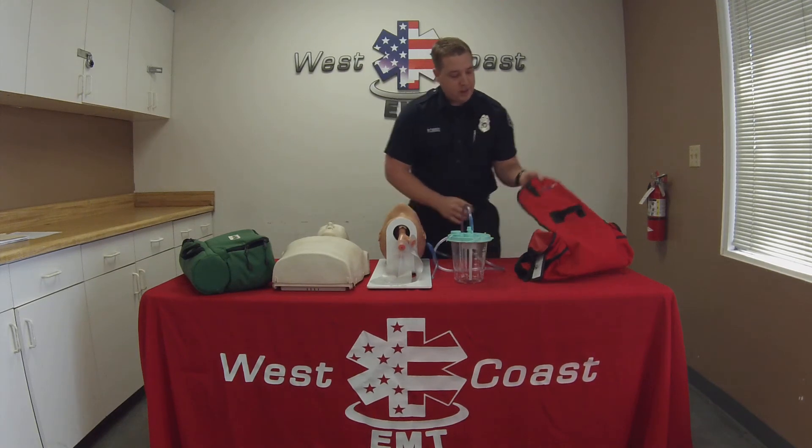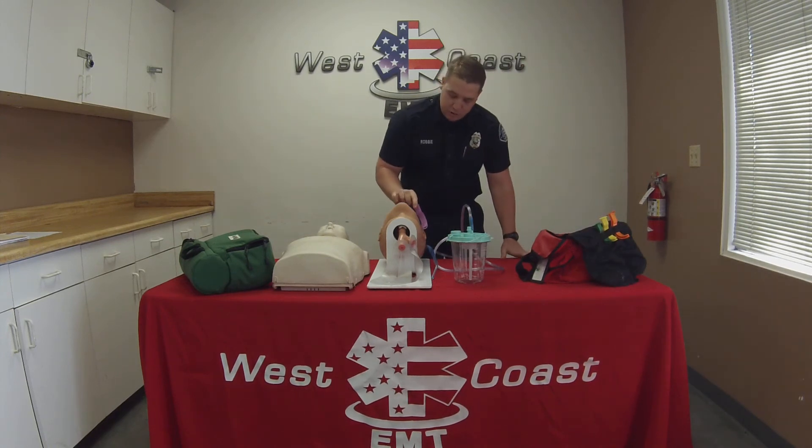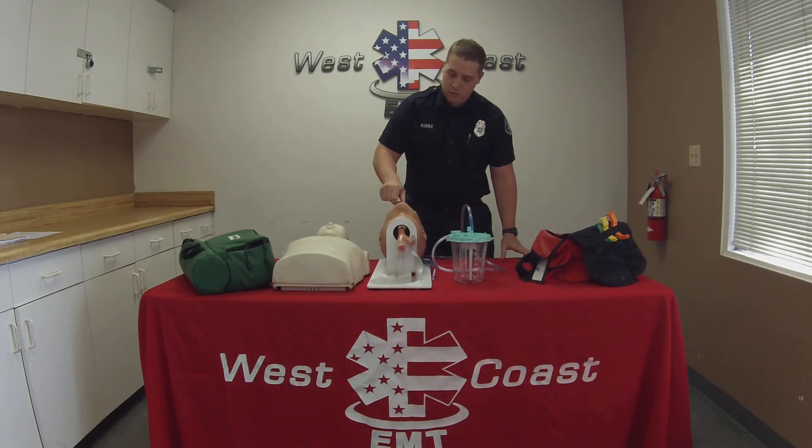I'm then going to establish my airway with an OPA. I'm going to measure my OPA as well, measuring from the earlobe to the corner of the mouth. No gag reflex is present and the patient accepts the airway adjunct.